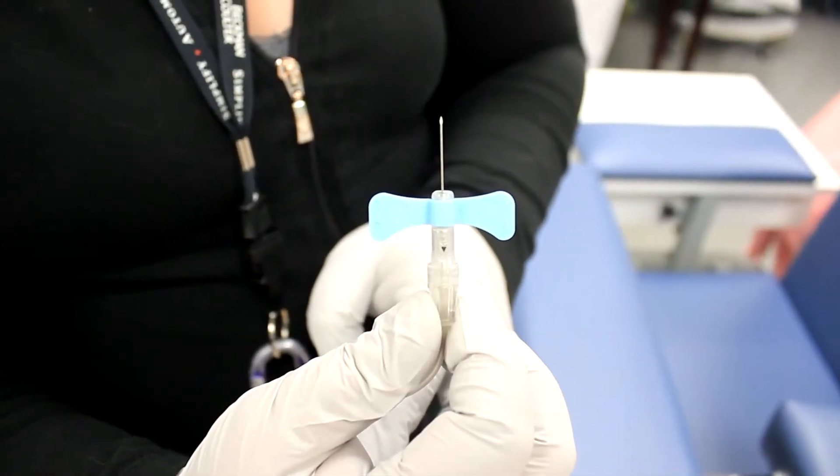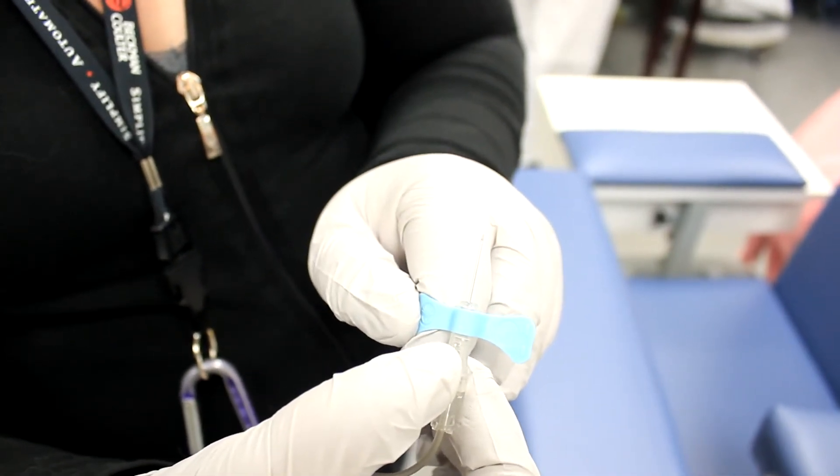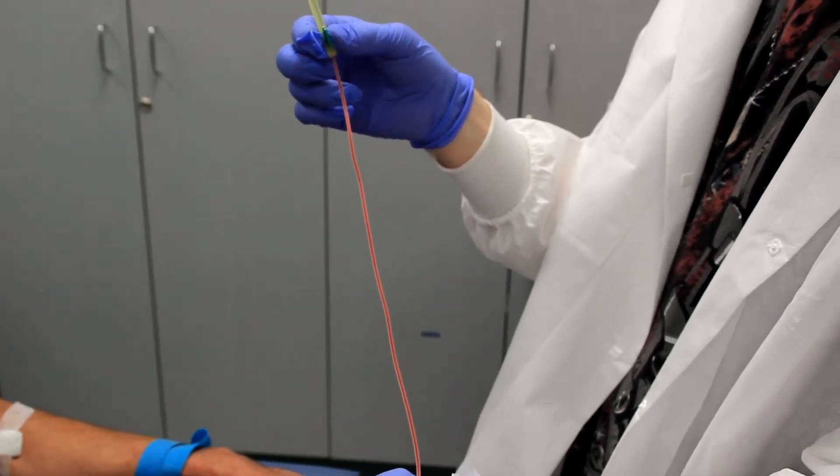After completing the venipuncture, apply gentle pressure to the plunger to withdraw the final traces of blood from the tubing. Always utilize transfer devices to transfer blood from the syringe.